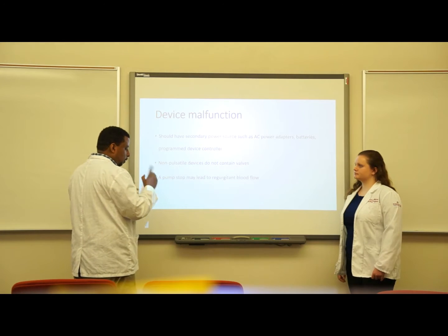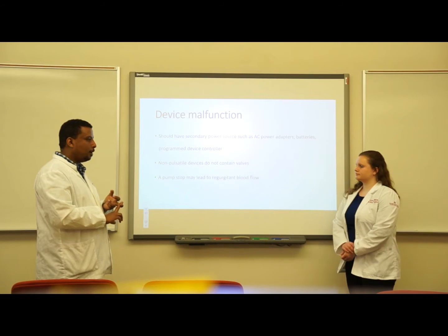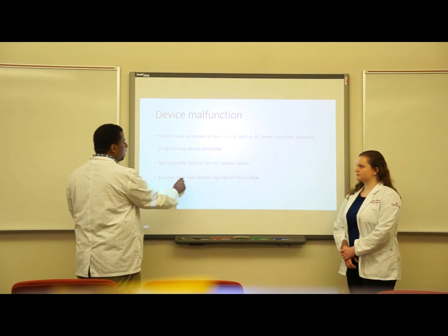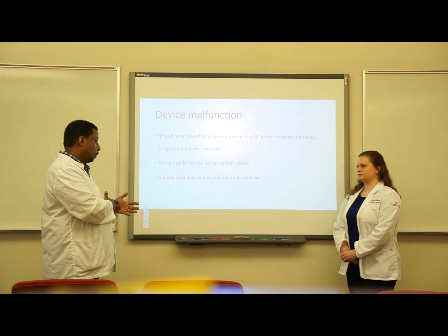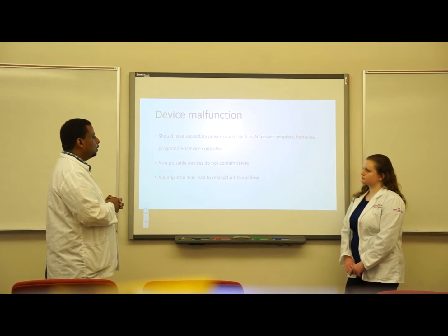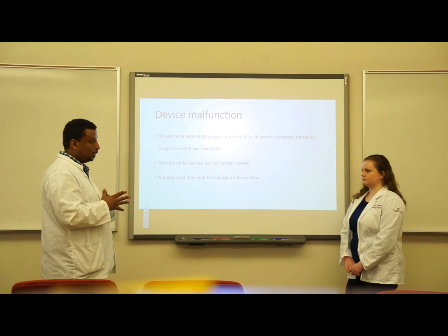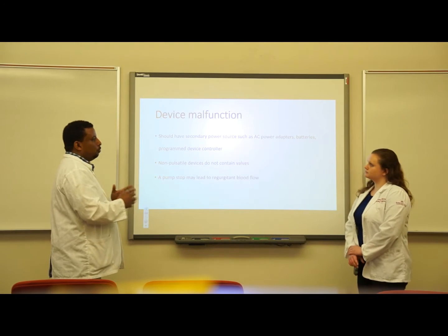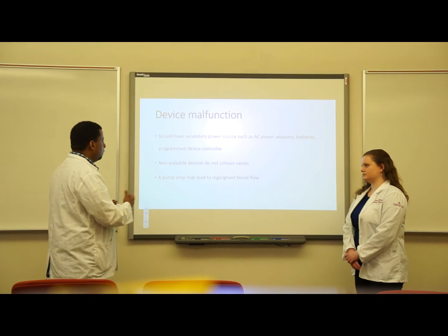We have to remember that the non-pulsatile devices don't contain valves. They have no valve. So what that means is, if the pump stops, that may lead to reverse blood flow, which is also drastic. So we have to be aware of device malfunction, and then we have to be prepared to have our secondary sets of devices. And also to communicate that to the LVAD team on our floor or to the physician.